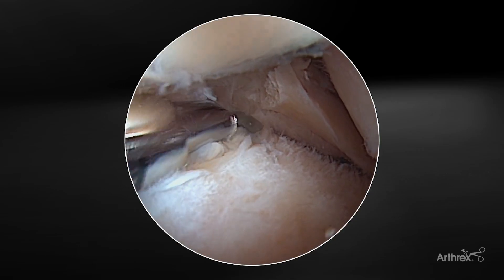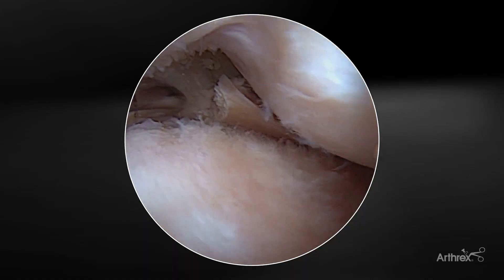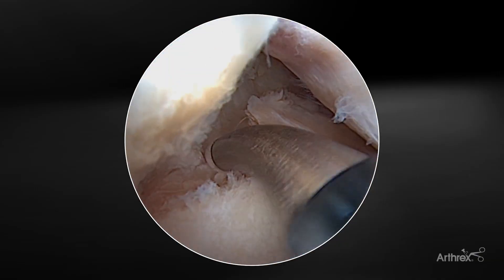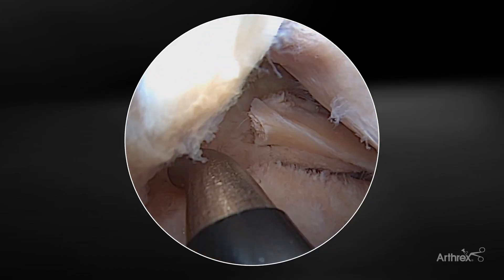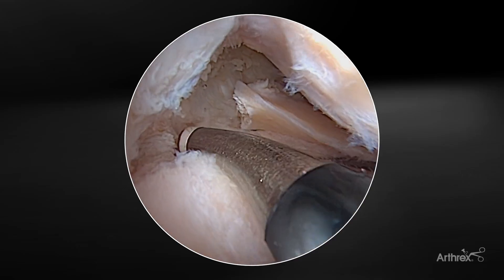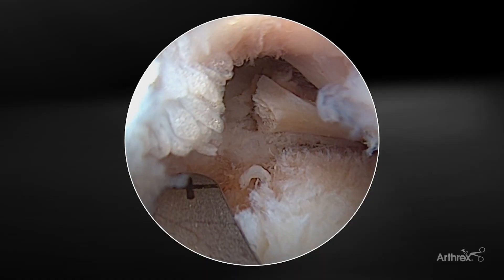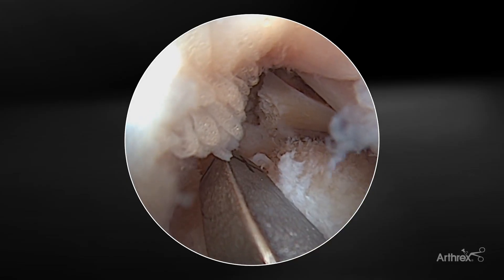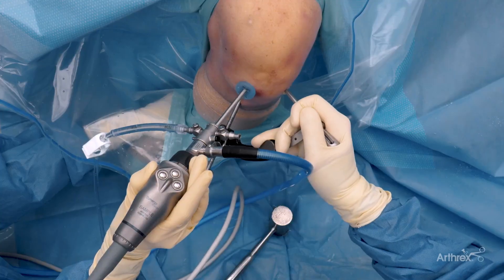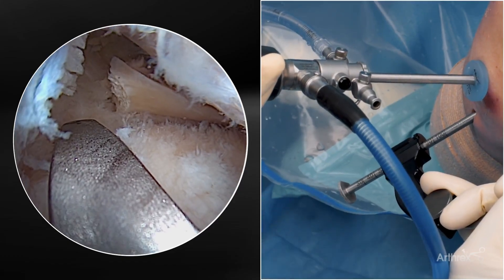I use a grasper just to assess the mobility of the posterior horn of the meniscus just prior to doing the repair and during the preparation to make sure that you have adequate mobility of the meniscus to come back to the root footprint. Preparation of the meniscal tibial footprint is one of the most important parts of the case in order to get a good biologic healing response of this meniscus tissue. The arthroscope is now placed in the medial portal because the trajectory of the instruments will be much easier. Now we're going to mark with the SJ50 where we want to come out anatomically with the meniscus root guide. The point-to-point guide is really nice because you have both the point to put on the meniscus root footprint and a really good aiming guide on top of the meniscus guide.